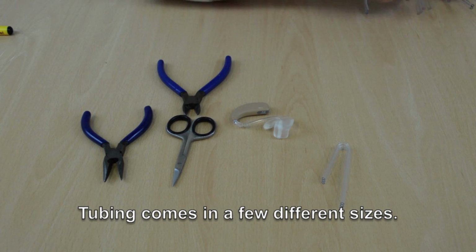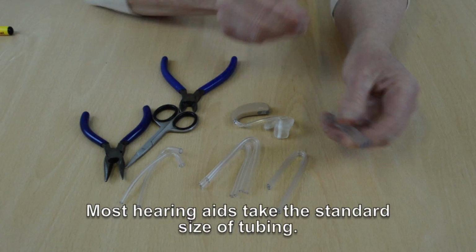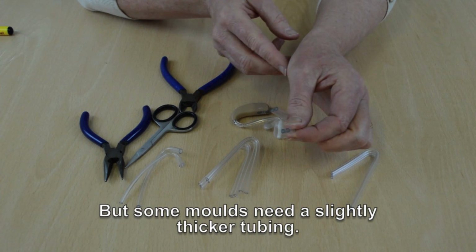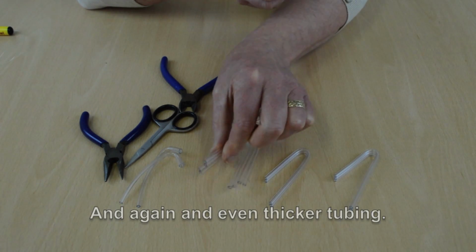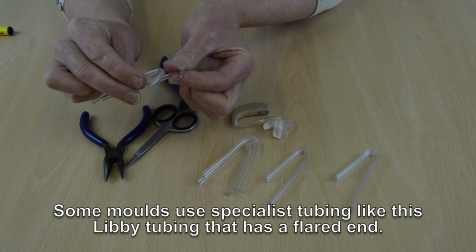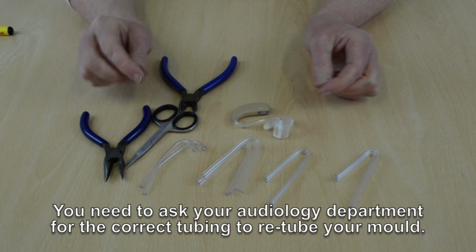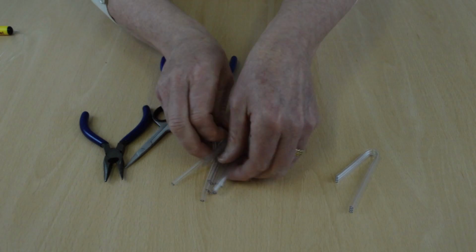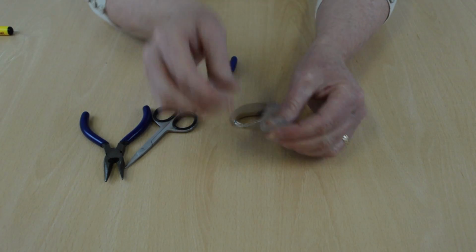Tubing comes in a few different types. Most hearing aids take the standard type of tubing, but some moulds need a slightly thicker tubing and again a slightly even thicker tubing. Some moulds use specialist tubing like this Libby tubing which has a flared end. You need to ask your audiology department for the correct type of tubing for you to be able to retube your mould. But most hearing aids will use a standard type of tubing.